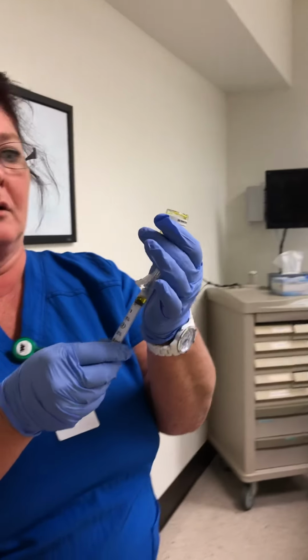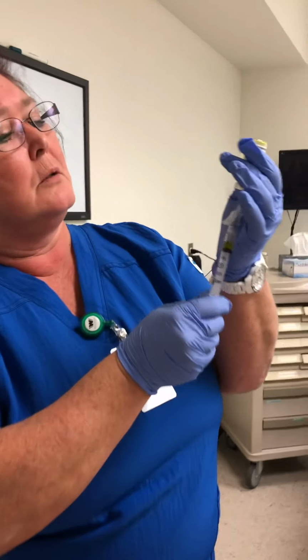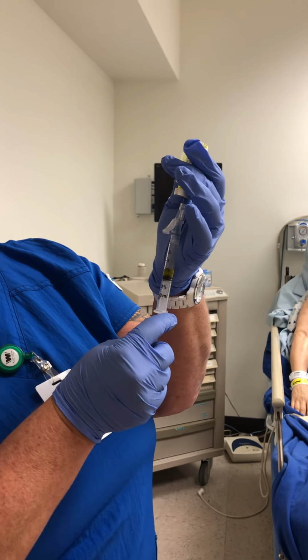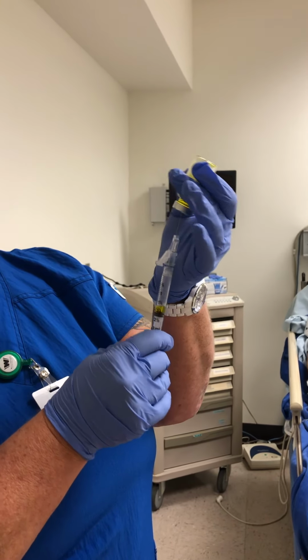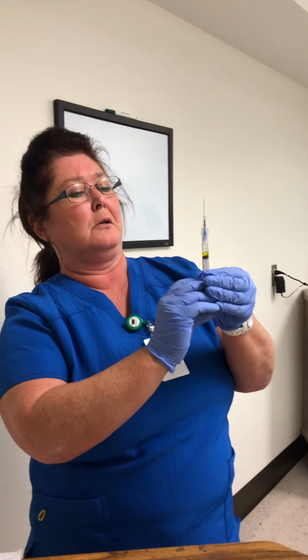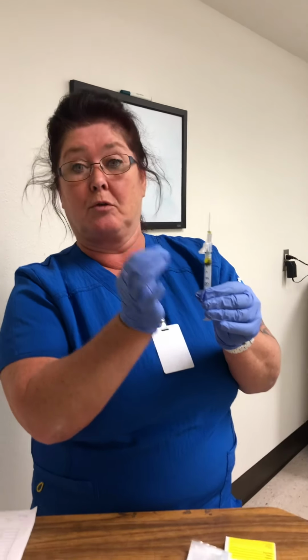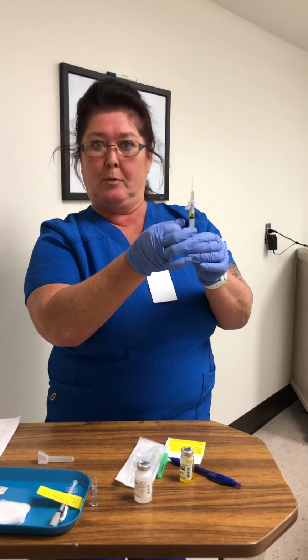Try mixing it a little bit more, maybe. Let's see if we got it. I can't get it to draw. Okay, so that would be 1 mil if I could actually get the liquid to come through the needle. We would tap this out, get out the air bubbles.